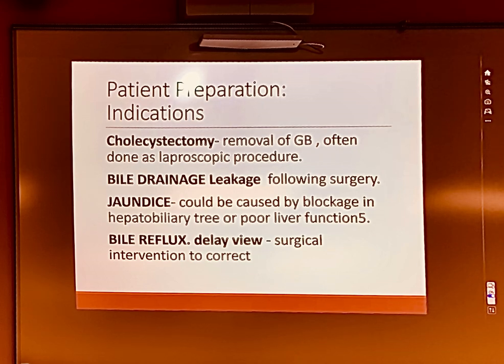And if it's really bad, their entire abdomen is bright yellow. We lovingly call them imaging big bird. We say, we got a big bird bed forward. Because that's the way to communicate what's wrong with your patient without breaking any kind of violation. No one's still going to be looking for big bird. But they're very easy to spot.